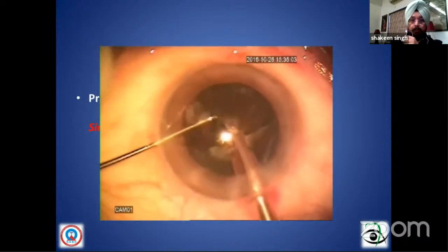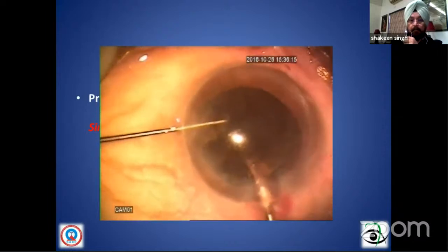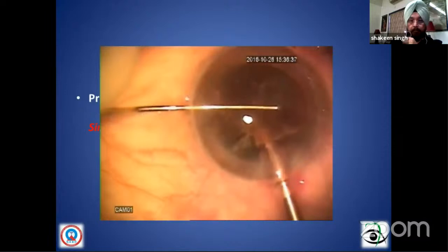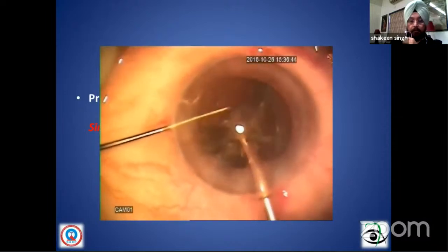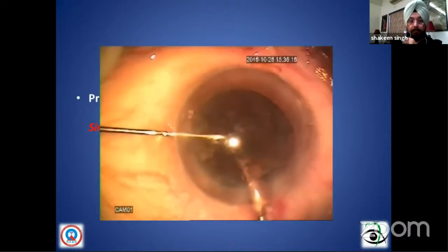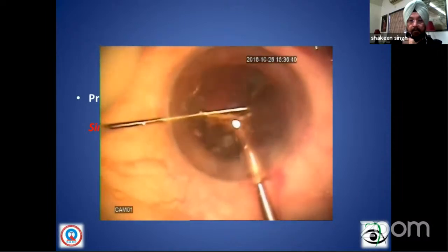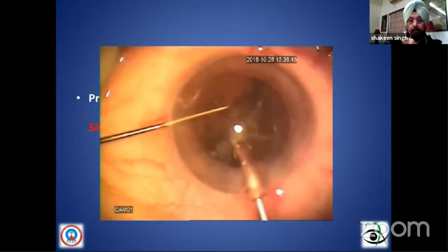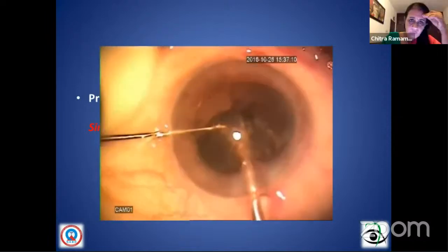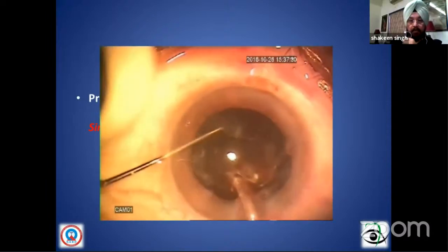And then you can use the chopper to do the vertical chop and the horizontal chop simultaneously in combination, and pull out the fragment out of the bag. That helps us to break, chop, and eat away. So this fragmentation covers the tip, breaking into small pieces, and then eating. I'm preferring my burst mode. I hold the fragment, and then I shoot the power with a burst raised to 70% of the on time, so that there is less endothelial damage, and eat away the harder part.